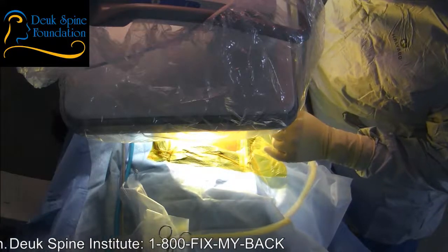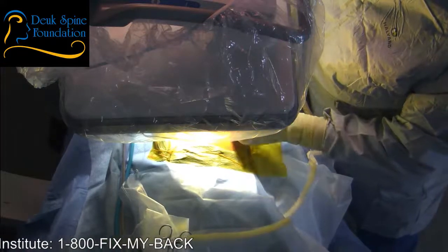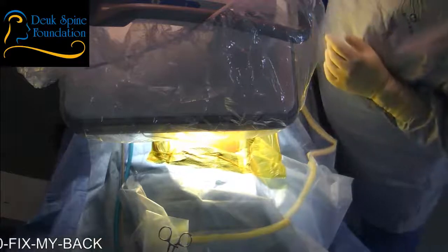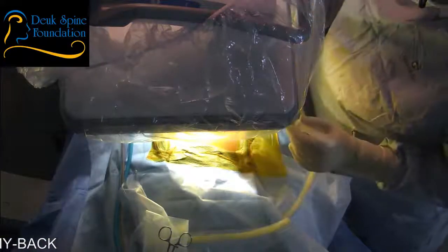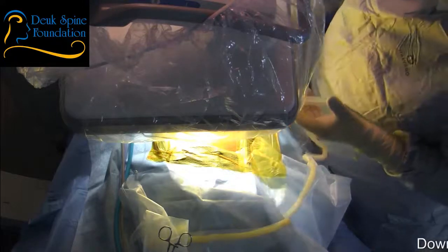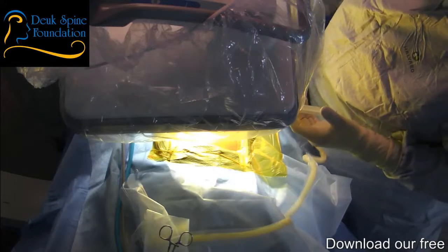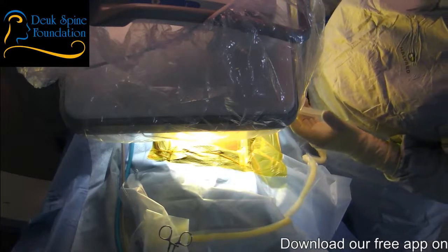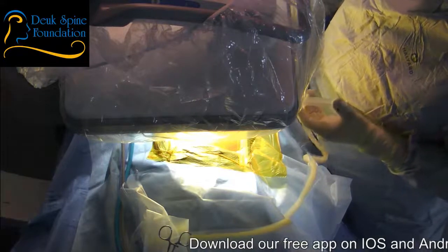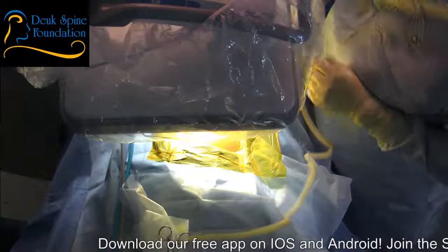All right, we're getting started. Let me have some numbing medicine. So in this patient situation, to kind of boil things down to what they are, we're basically treating his back pain and his radiculopathy, which is the nerve problem, pinched nerve problem.